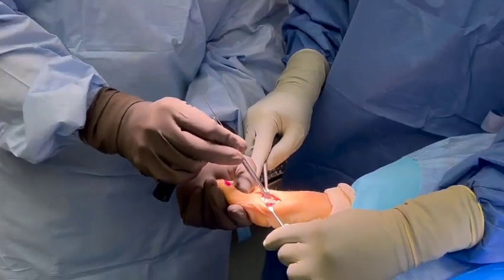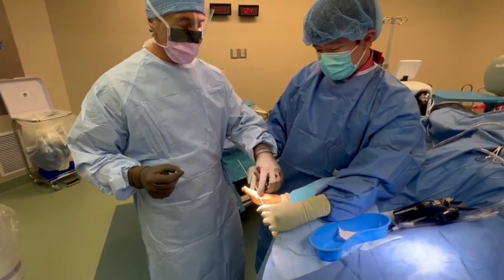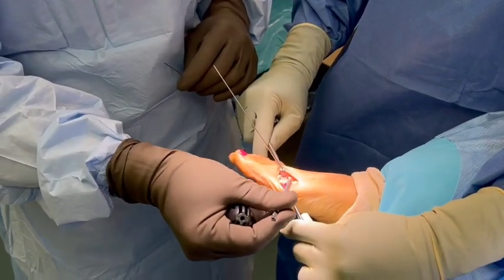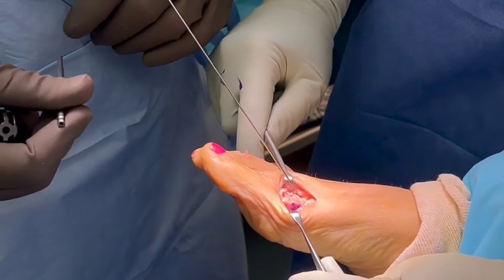Come right out. And we'll remove the stabilization pin. And that's it. I'm going to get a close-up of this. That natural bone product will absorb and incorporate into the bone, and you'll never know there's any fixation.